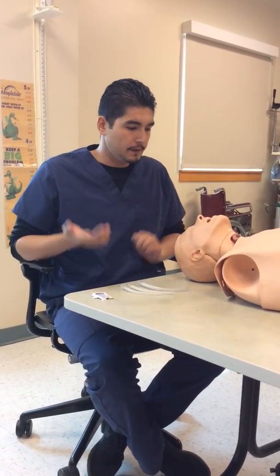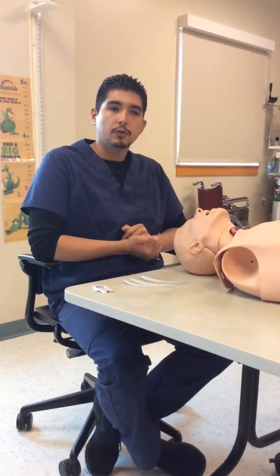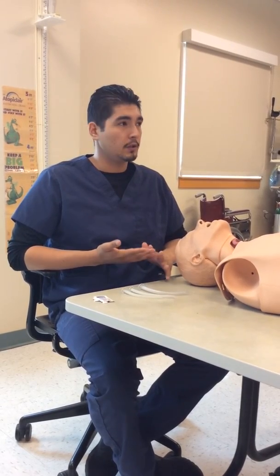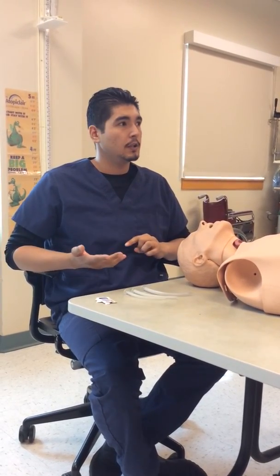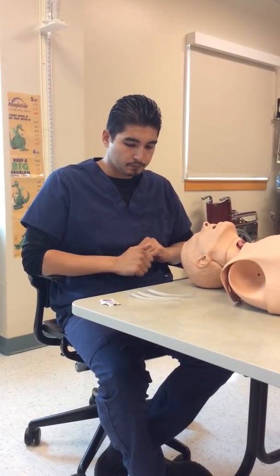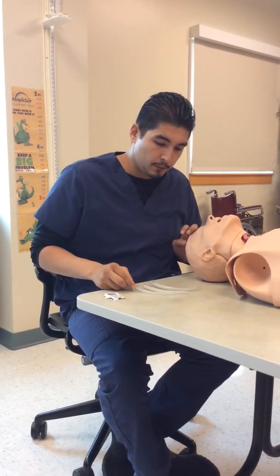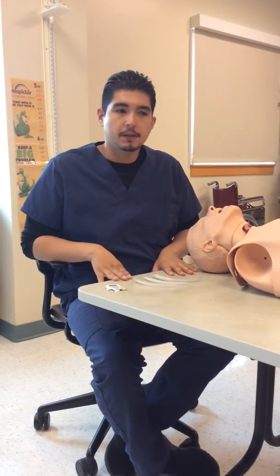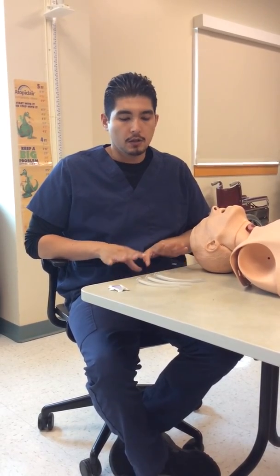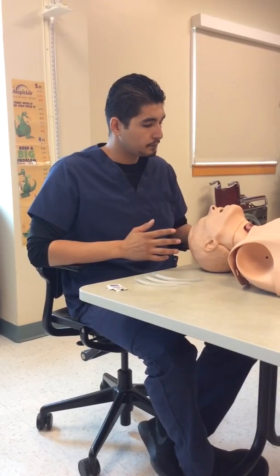So after you verify the physician's orders, you can check the patient's chart, and that should tell you why this patient might need an NPA, or it can also give you the contraindications. It will let you know what you should expect when you go inside the patient's room. You want to gather your equipment. So here we have NPAs from various sizes, so it's a good idea to take multiple if you don't know anything about your patient. It's a good idea so you're prepared for any situation.